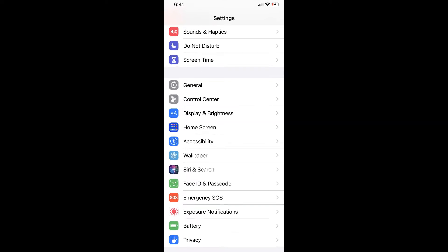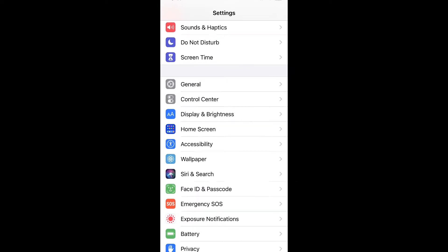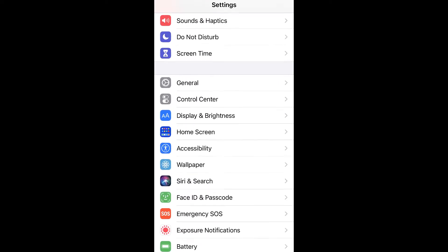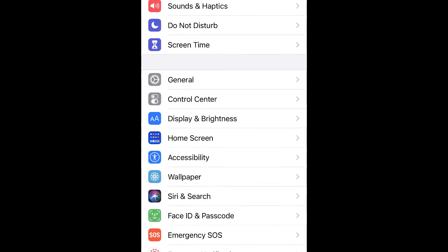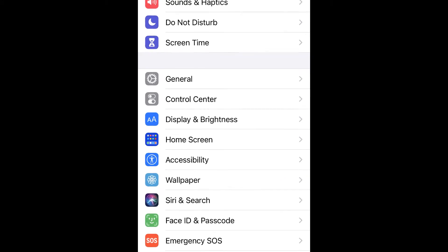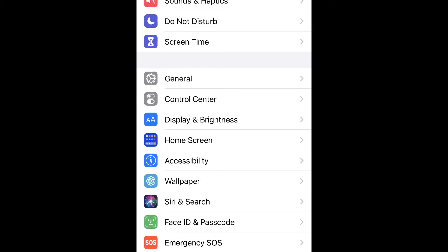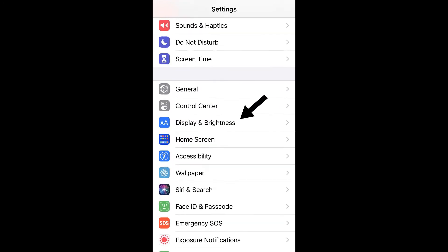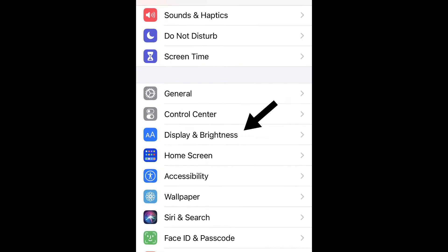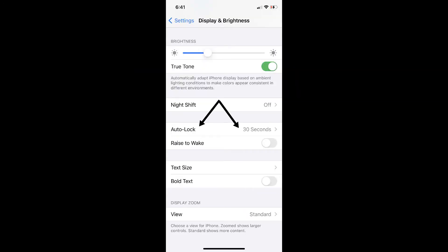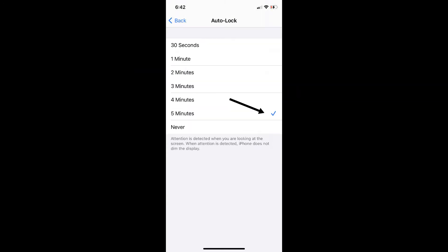Setting up your iPhone: confirm or change a couple of iPhone settings. Go to Settings, scroll to Display and Brightness, then select Auto Lock, and choose three minutes or longer.